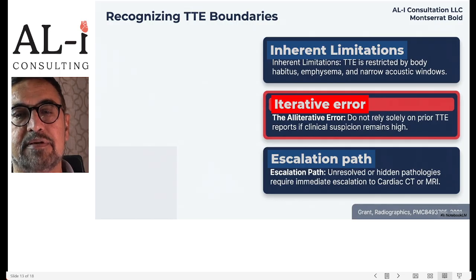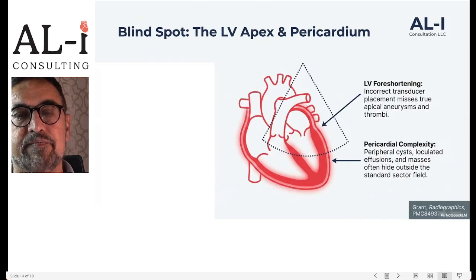It is equally important to know the boundaries of transthoracic imaging. Not every structure is well seen from every window. Not every pathology can be confidently ruled in or ruled out with focused ultrasound. You should learn what good judgment includes, recognizing when the exam is limited and when formal echocardiography is needed.